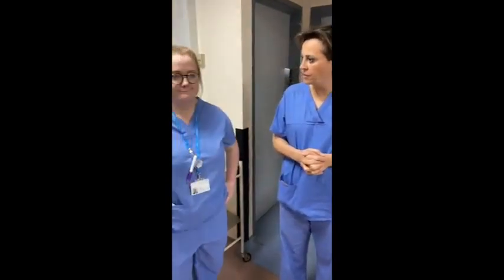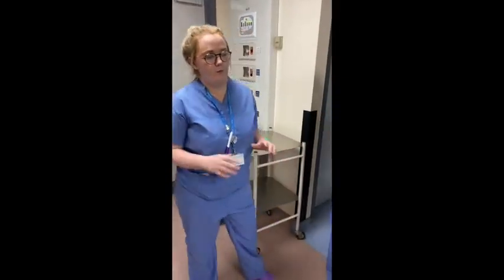Okay, so what we're going to demonstrate is what happens when a COVID positive patient comes into the lab. Lab D is going to be the COVID lab. So Emma is going to take us through all the various steps. Off you go. So once we find out this, we'll come to lab D. The patient will have not entered the lab at this point.